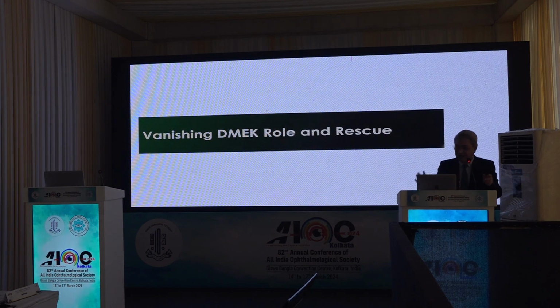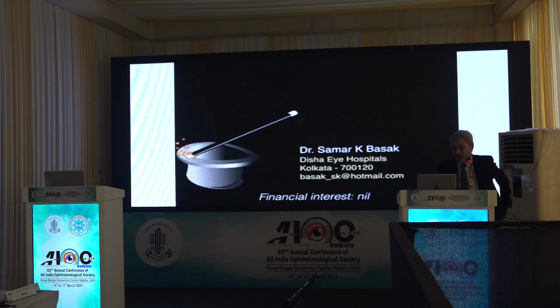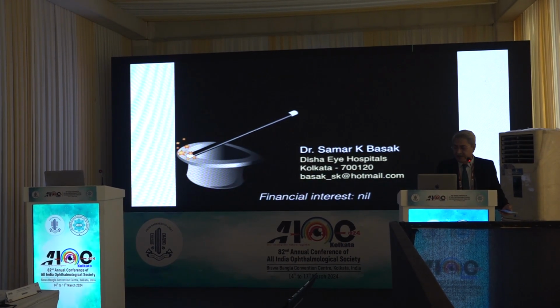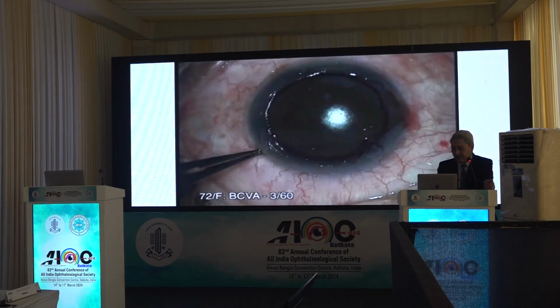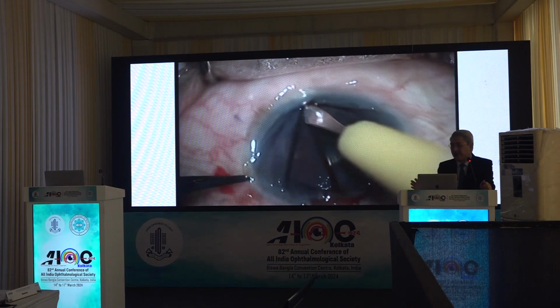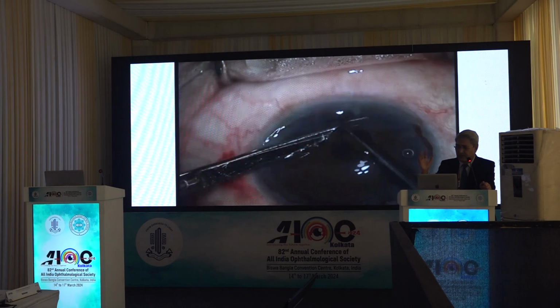This is my old video, vanishing DMEK roll and rescue. This is again a case of post-VR with SFIOL. I didn't know the history, it was obtained from the patient, that it was a VR surgery, an old patient.